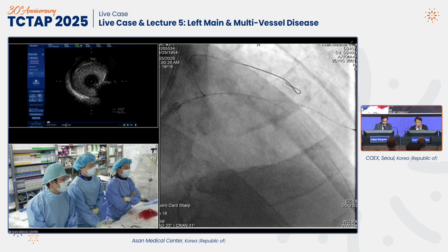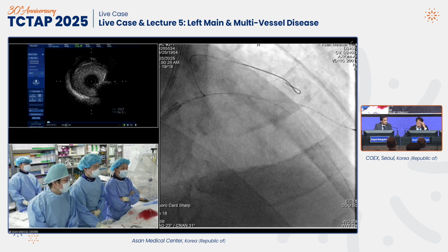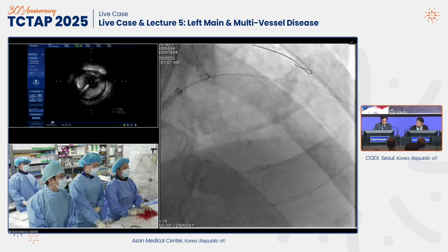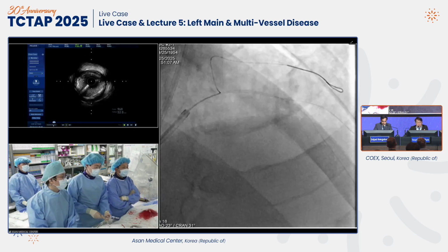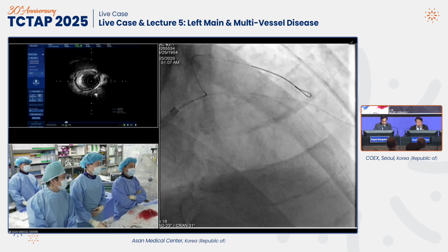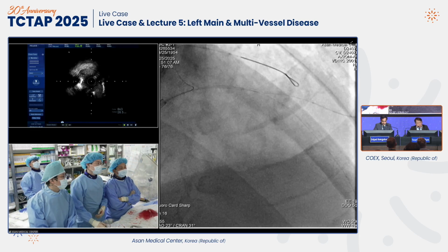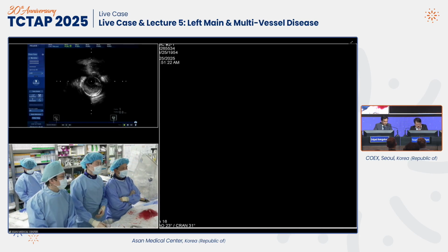I think I wanted to just put two stents for the diagonal branch, and then you're going to have another option for the main stem procedure, crossover and provisional treatment, etc. However, in terms of the diagonal branch, I think it's quite enough to treat more than 2.5, almost 3, with crush and another. Let's go ahead. It's your case.